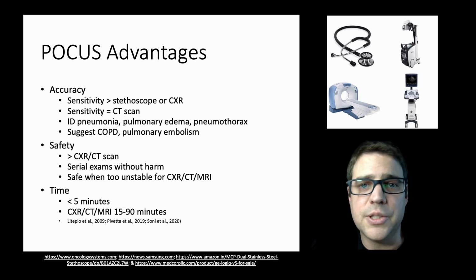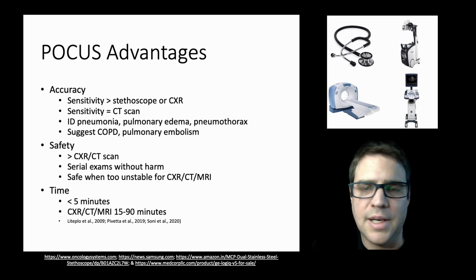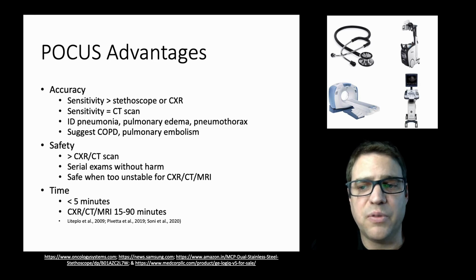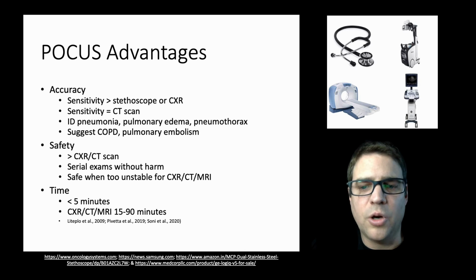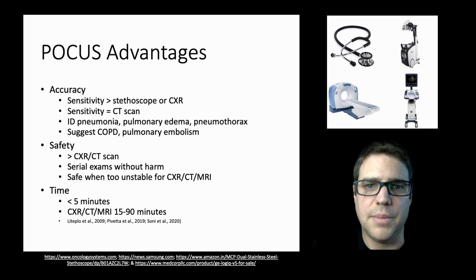POCUS is safe. POCUS is safer for the patient than a chest X-ray or a CT scan because it emits sound waves and not ionizing radiation. It is this fact that allows serial POCUS exams to be performed without additional harm to the patient. Furthermore, POCUS can be performed on those patients who are too unstable for a chest X-ray, for an MRI, or a CT scan. POCUS is also timely. Point-of-care ultrasound can be done in less than 5 minutes, whereas a chest X-ray or a CT scan can take anywhere from 15 to 90 minutes for results to come back.